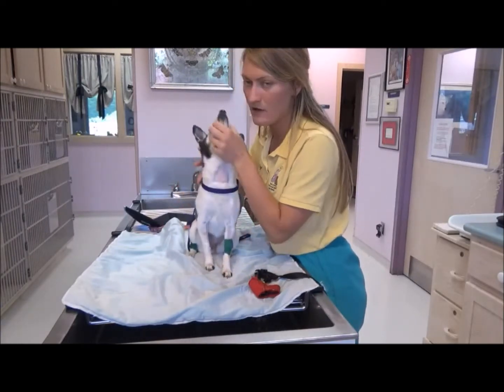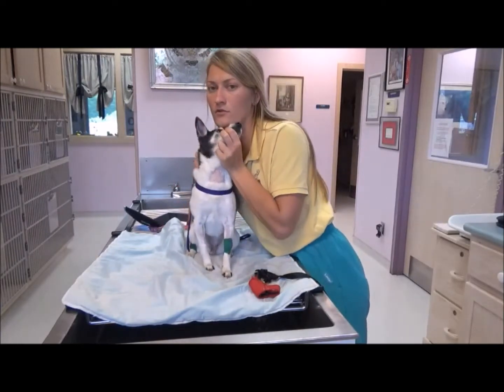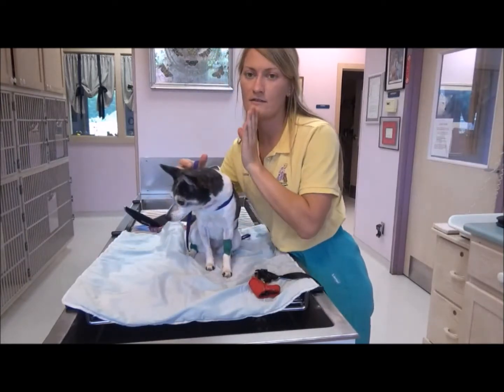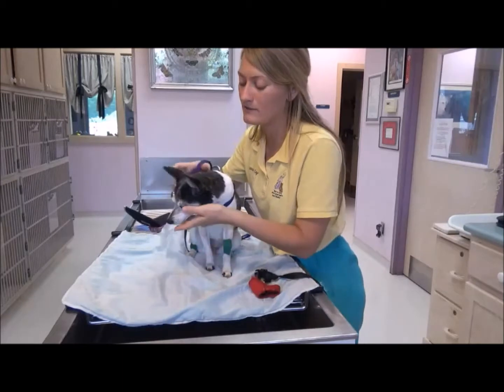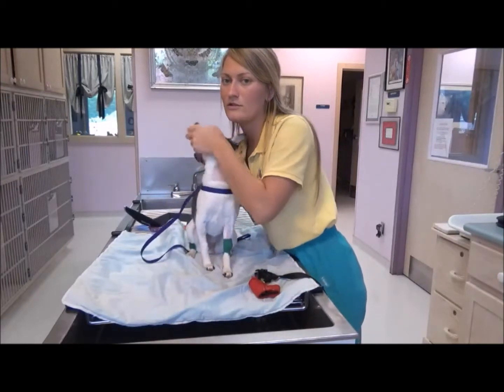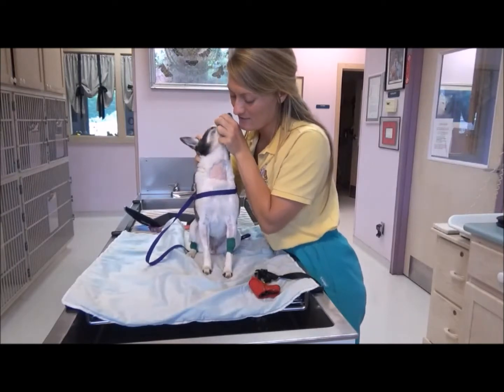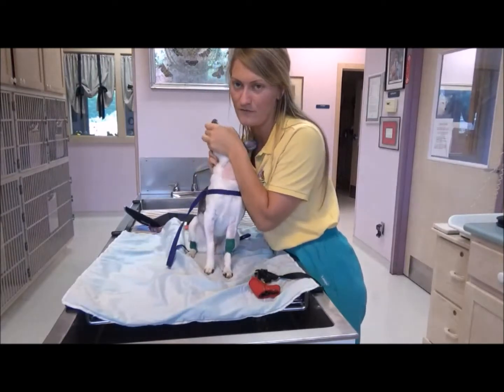For a jugular blood draw, you can have your patient either sitting or in sternal recumbency. You want to make sure that you hold their head up in whatever direction the person collecting the blood sample needs, and obviously face their head towards the person collecting the blood sample. Just when holding their head in place, you want to make sure that your hand doesn't block the view of the vein.